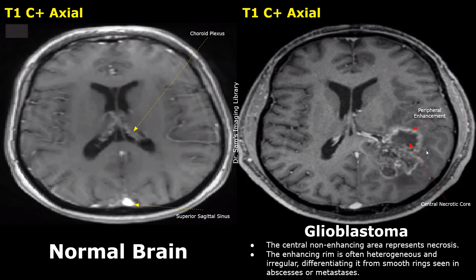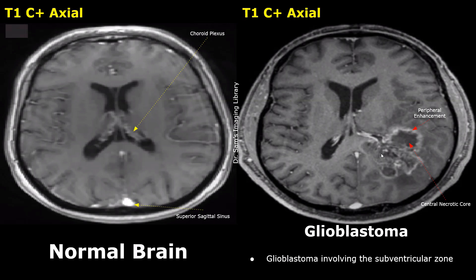In this T1 contrast image, an irregular-shaped heterogeneous mass is present. Apart from the irregular shape and heterogeneity, a glioblastoma will have two distinct features in a T1 contrast image: the mass will have a bright enhancing peripheral rim and a hypo-intense dark central necrotic core. The enhancing rim is often heterogeneous and irregular, differentiating it from smooth rings seen in abscesses or metastases. This glioblastoma involves the subventricular zone, and its irregular and heterogeneous appearance indicates that it is a malignant infiltrating lesion.